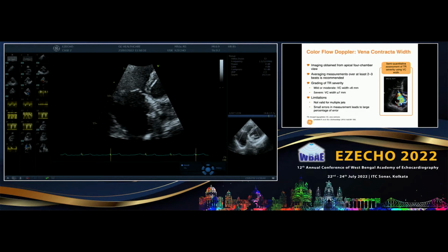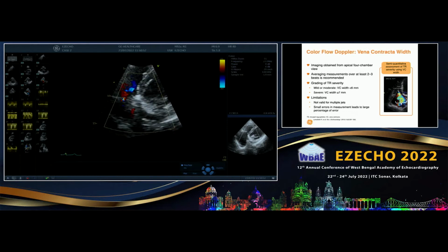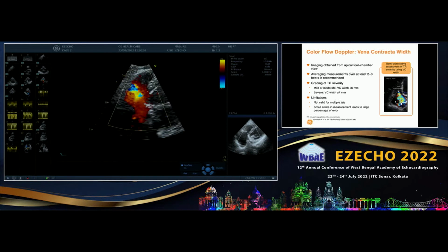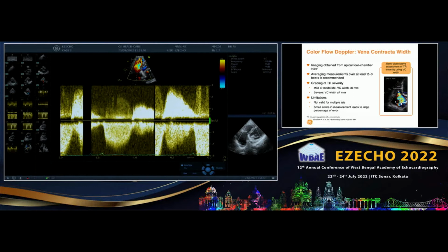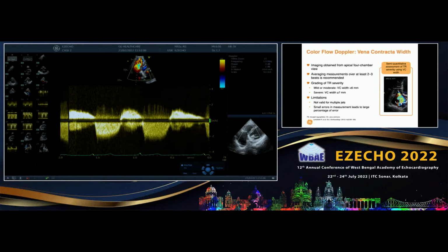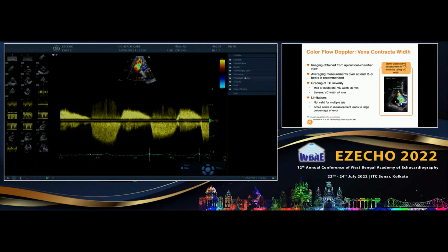So this is there. And is there any PR? So we can have info. Get the TR envelope, you take it. We will also always try to see for tricuspid stenosis. Are the tricuspid valves thickened? Yeah, they are thickened. And there is a forward gradient also. Unless you get such an envelope, do not measure the TR. If you just get a small one, then don't take the feathers. You take the outer border of this one. How much is the peak velocity?